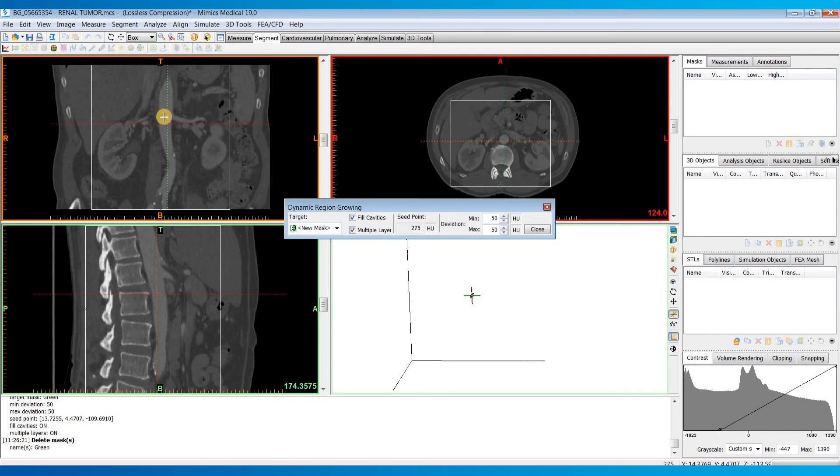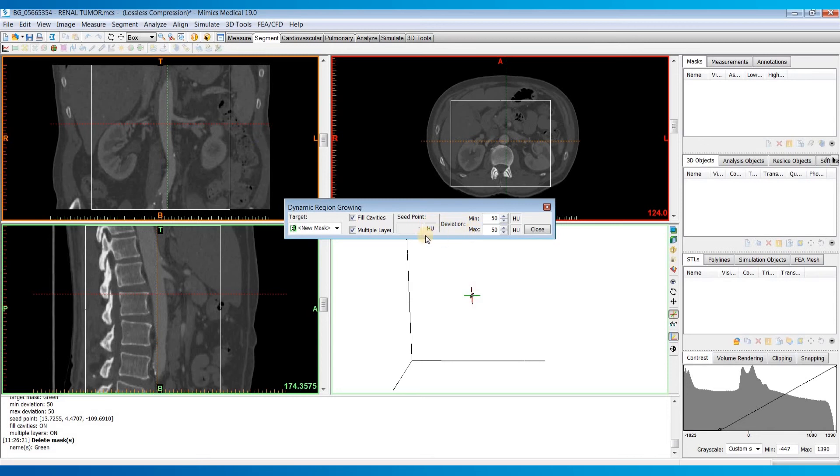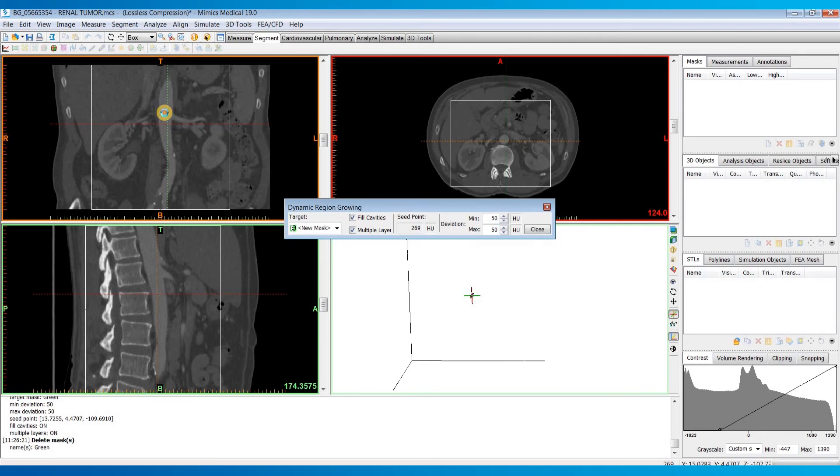And so once I choose that seed point, it's going to grow out to any of the connected voxels that are within this deviation of that intensity value. So let's go ahead and just left click right in the middle of this aorta.